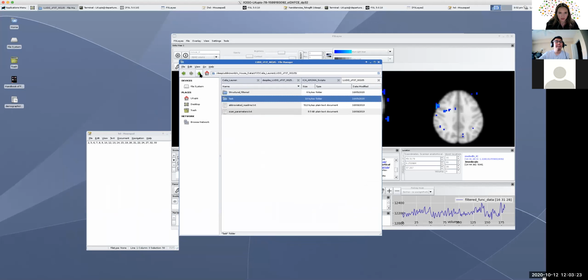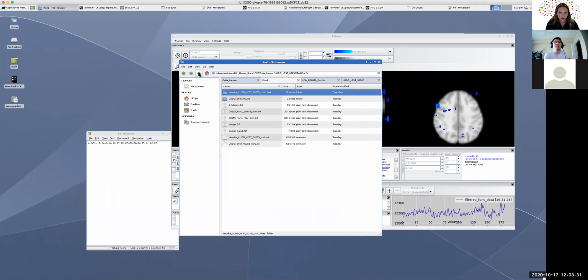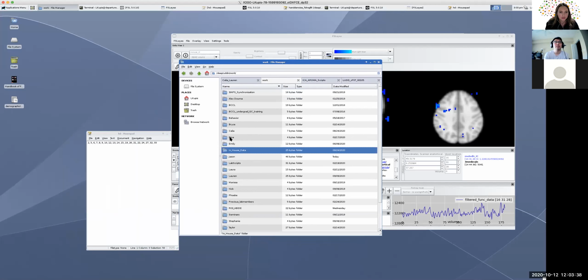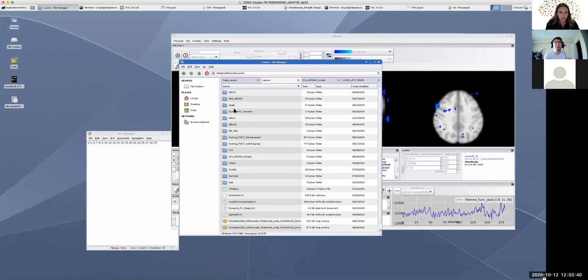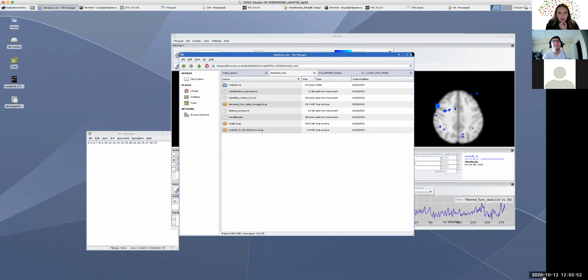Okay, that's fine. Let me just go back. Okay, so this is what it should look like after fMRIPrep.